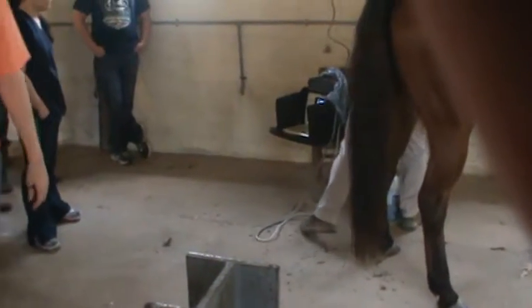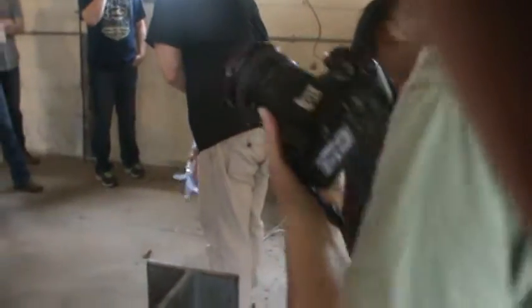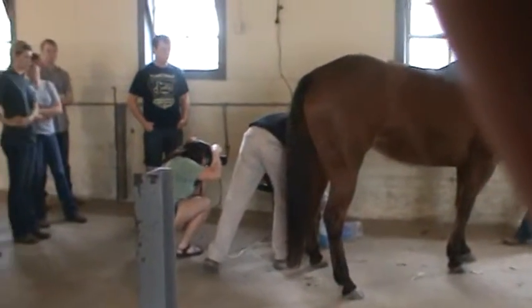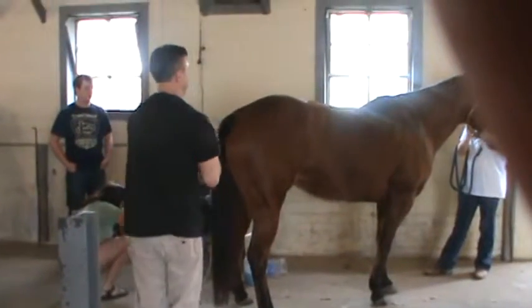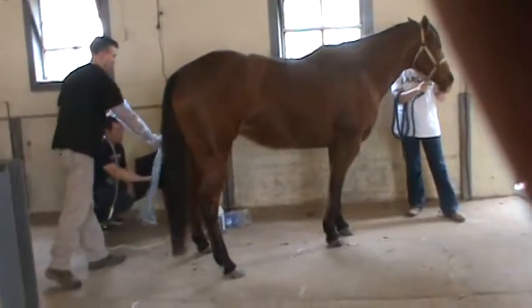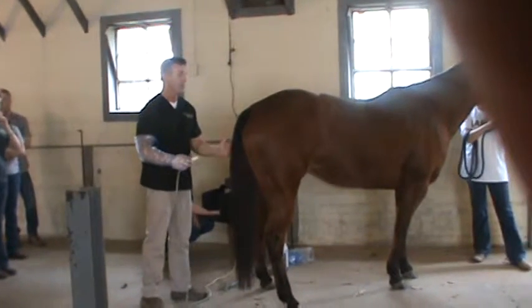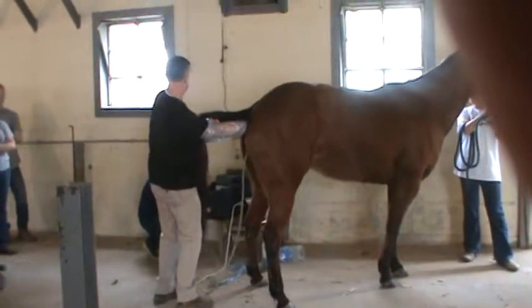So that's what a normal ovary would look like. Let's see if we can find the other one, and we'll be able to see what that looks like. Whoa. She's tolerating really badly. I'd like for you to be able to see the CL structure. Remember that you cannot feel the CL in a horse. I can feel those follicles, but the CL is always going to be at that ovulation fossa, so you can't feel that. Poor girl.